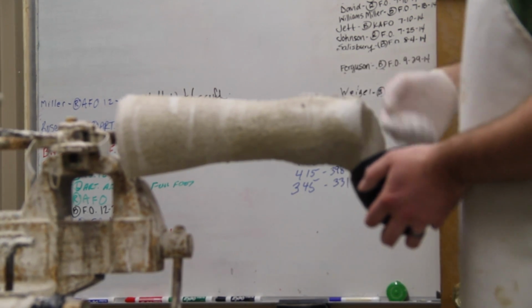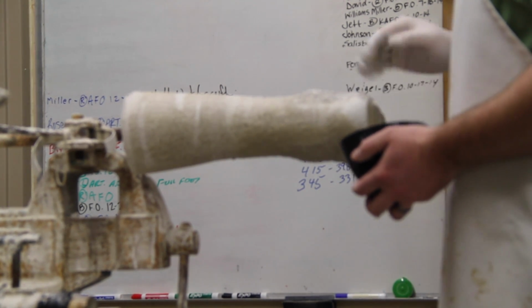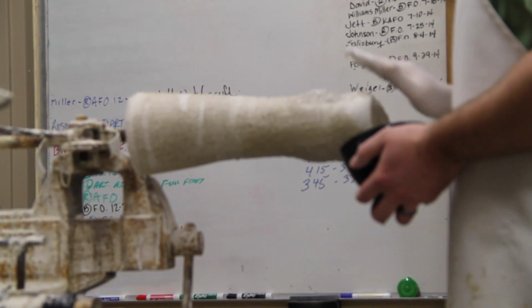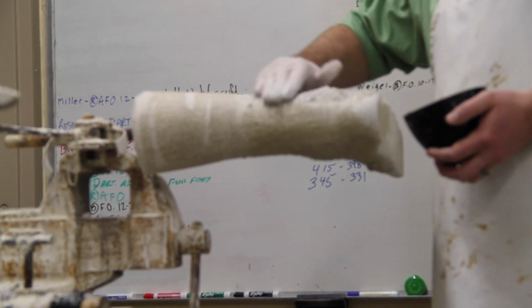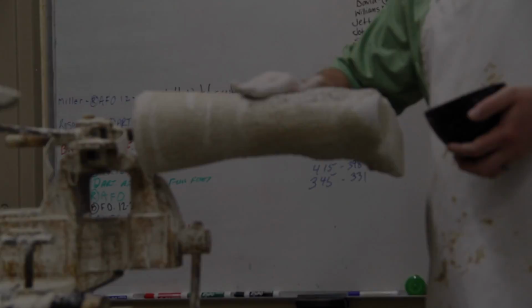As a patient stands, their ankle's going to compress and expand a little bit. We want to allow for that modification so the plastic doesn't hit the bony prominences of their ankle. Once the modifications are completed, then we'll vacuum form the plastic around the plaster, and then we'll be able to finish out the final cast.